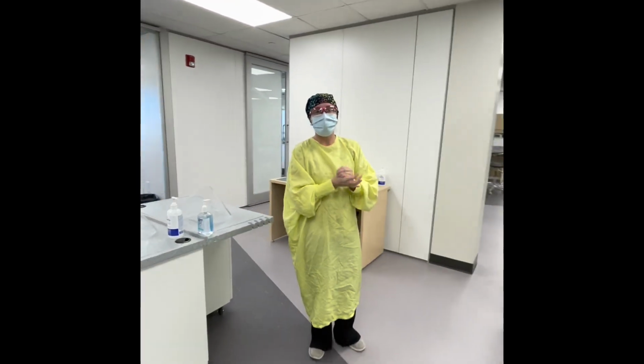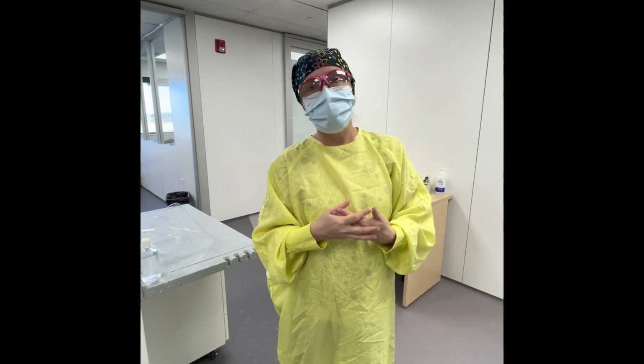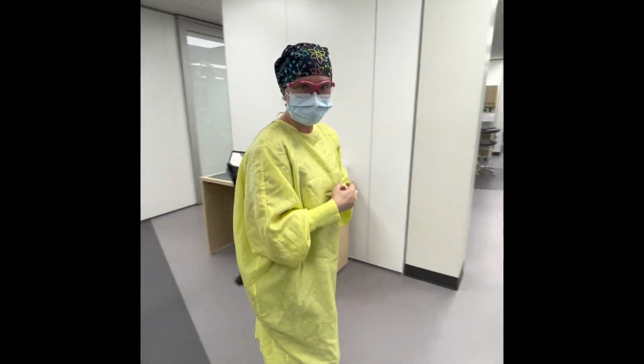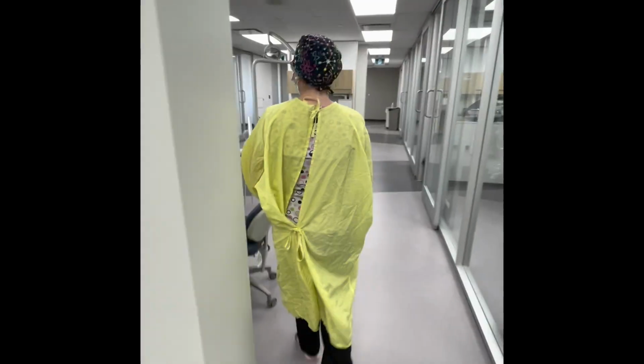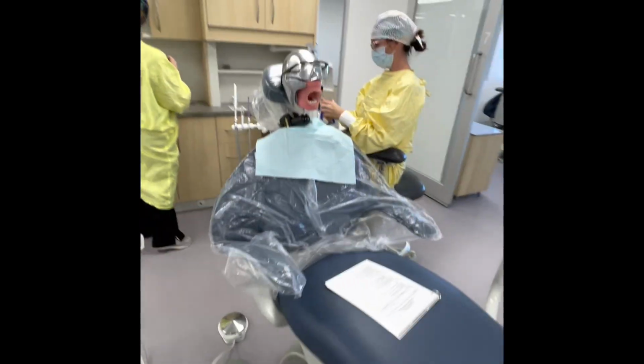With this procedure, we will be wearing our shields more for the fact of getting you guys used to using them, and you will be using them for restorative procedures. So we'll have them out for you when you come in for clinic that day. So we will proceed back to our unit, and Stacey and I are both going to get our gloves on.